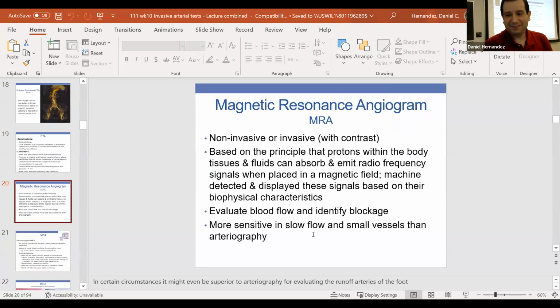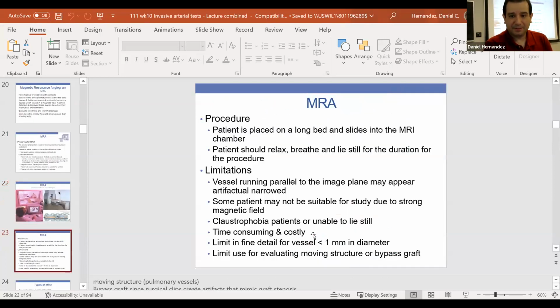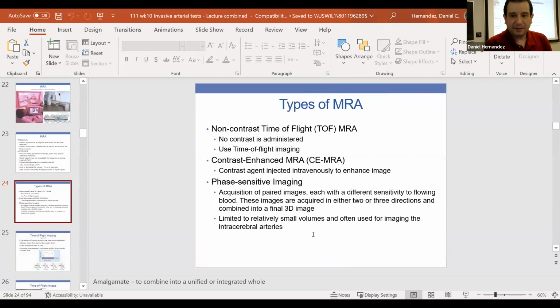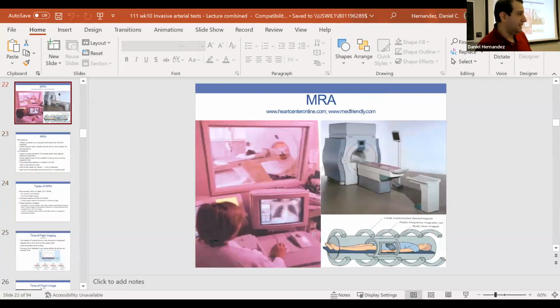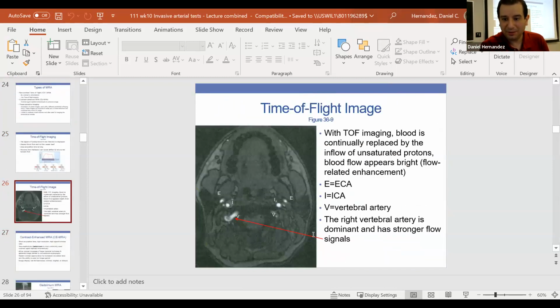Can't they see tendons? They can. Yes. With those, they typically don't do contrast for looking at the tendons and ligaments. They just put you in there. The contrast helps to really make the vessels stand out, so you get a good, clear picture of the vessels. Like we said, we can do it without the contrast, the image just isn't as good.